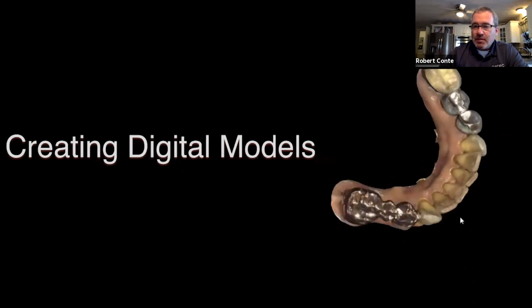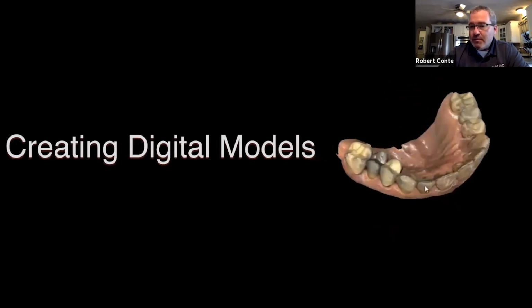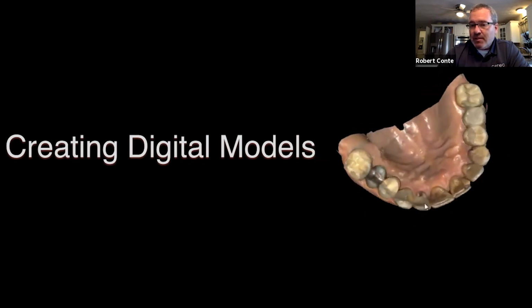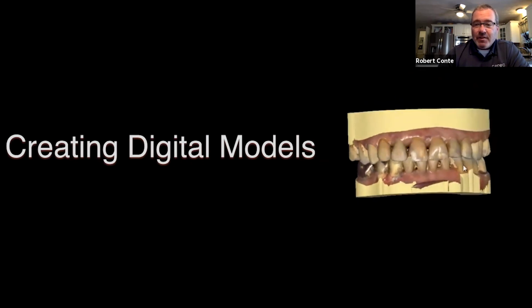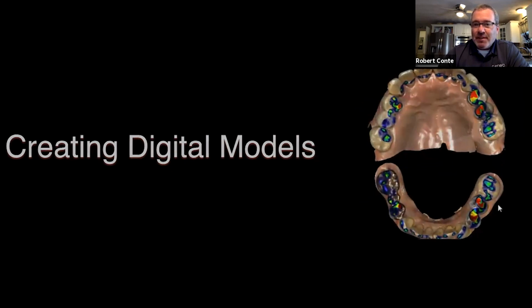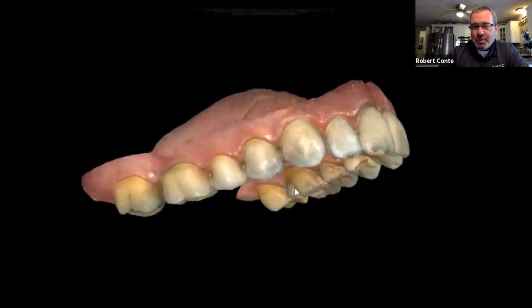Jim, these are your conditions. This is what I'm seeing. Ask for them to bring up what they see. They're going to ask a lot of questions. You start blowing up their teeth 20x on a digital monitor. They're going to understand and co-diagnose their problems.